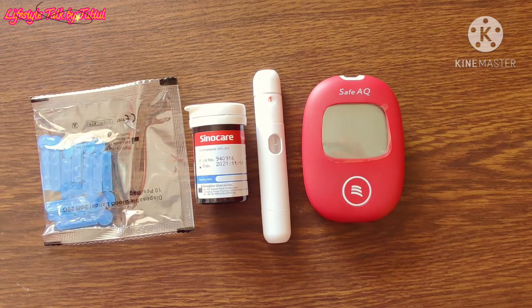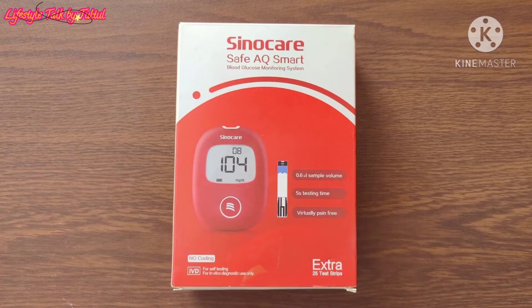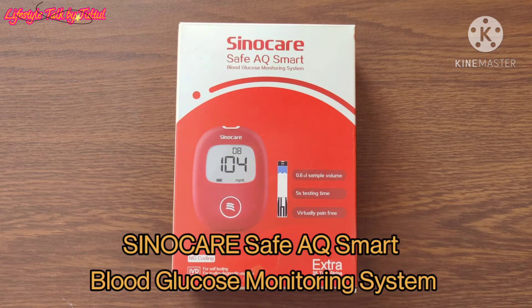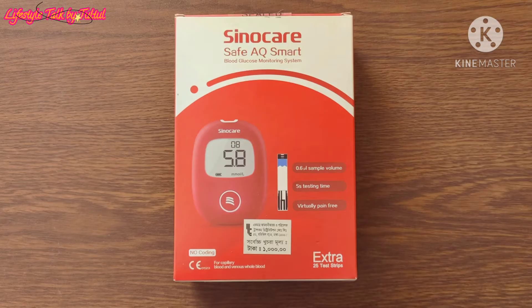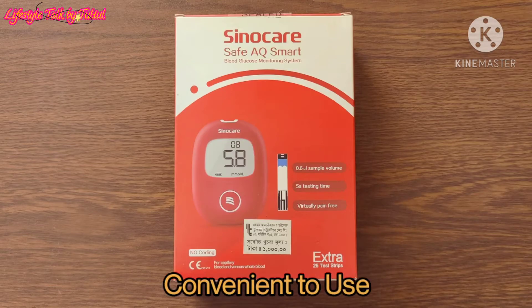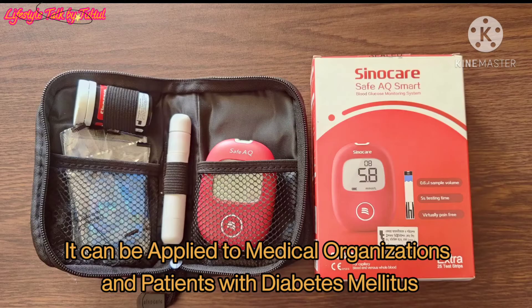Assalamualaikum, welcome to Lifestyle Talk by Tultul. Today I'm back again with this week's video. We are going to learn how to use a lancing device and a blood glucose meter. I am going to use the Sinecare Safe AQ Smart blood glucose monitoring system. It is easy to operate and convenient to use, and it can be applied to medical organizations and patients with diabetes mellitus.